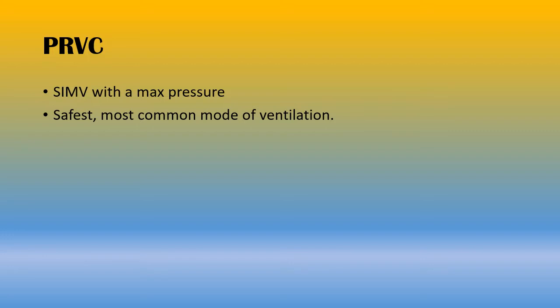And when you go into hospitals, you'll see on most of the hospital ventilators, the patient is on PRVC. And when you think, well, I can't take the patient because my ventilator doesn't have PRVC, it's fine to take it on SIMV because most transport ventilators will have an alarm if you go over a set pressure. So while it may not terminate that breath like PRVC does, it'll set off an alarm so you can know something's up. Hey, the patient's waking up. Hey, we're giving too much tidal volume. Whatever, our pressure alarm is going off, so we know to change something.